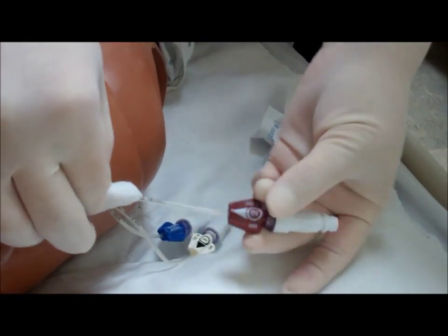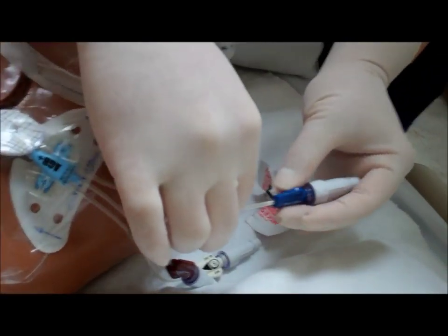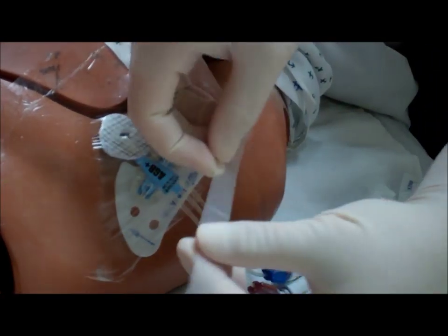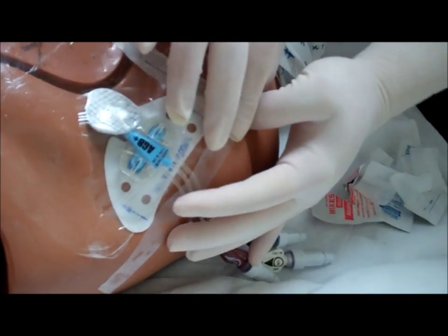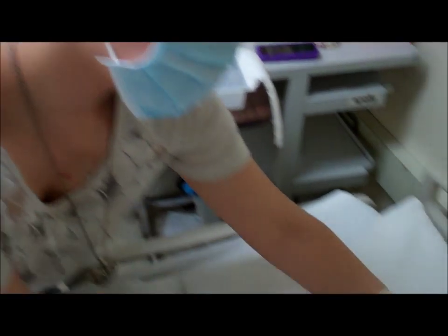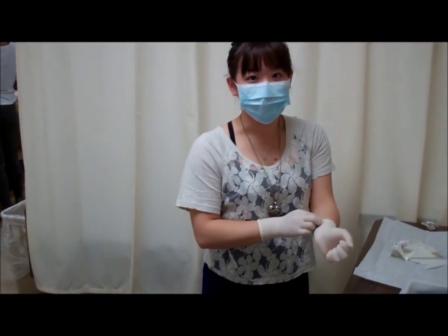And the middle, like so. And the one closest to me, like so. I want to make sure that I can also secure the catheters with another piece of tape, just to make sure that they're in place, and make sure that they're all clamped, and cover my patient up and tell him it's okay for him to turn his head now. Thank you for your cooperation. Make sure that he's comfortable before I leave the room, and clean up all my supplies and document all that I've done.